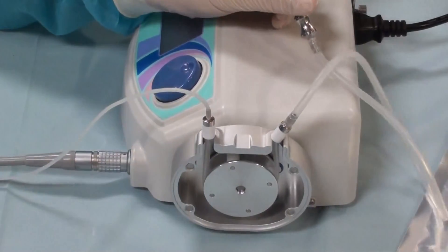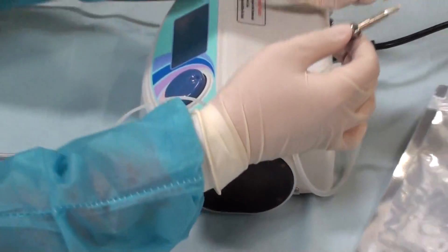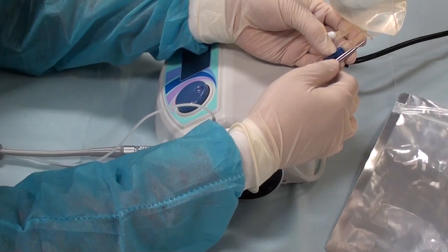Then get your cover, cover it back up, plug into the water source, and you are ready to go.